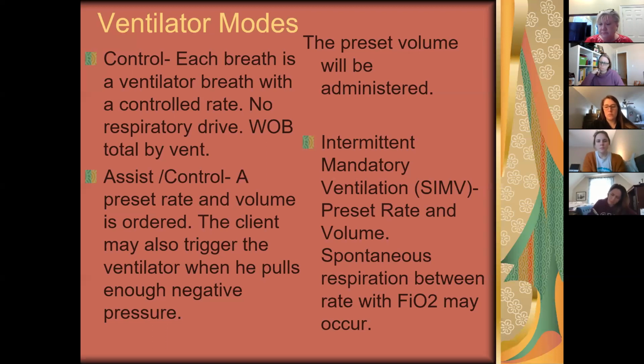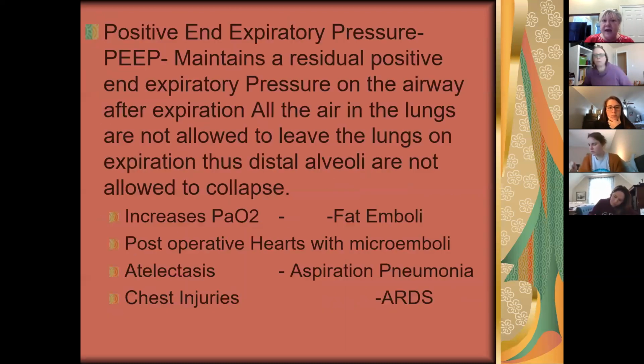Now, I got to go past the ventilator criteria. Now you have some other things that are dialed in there. And one of these is positive end expiratory pressure, called PEEP. Okay. Now, normally you and I, we inhale, our alveoli pop open and gas exchange takes place. Then when we exhale, our alveoli come back down and gas exchange does not take place.